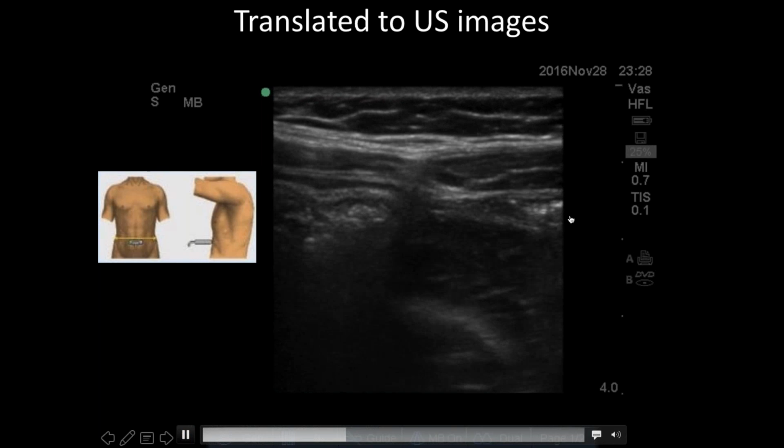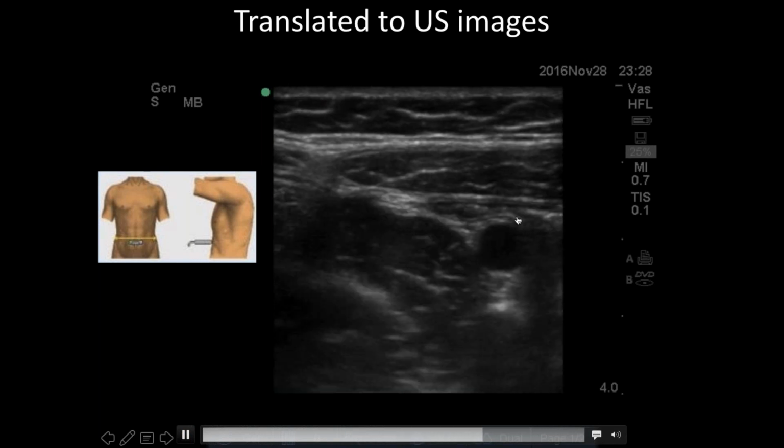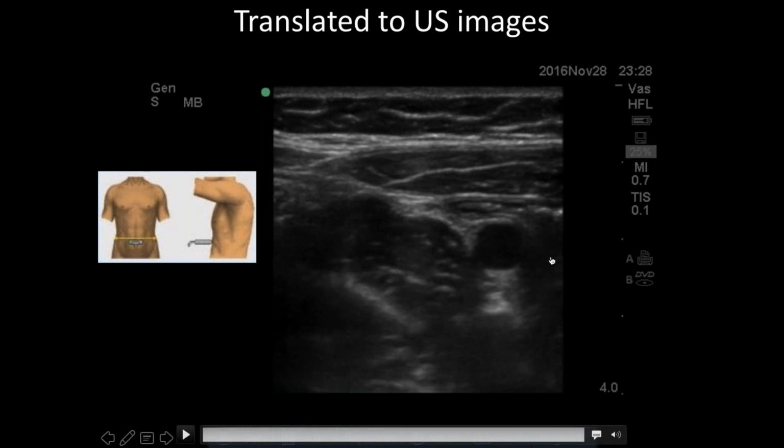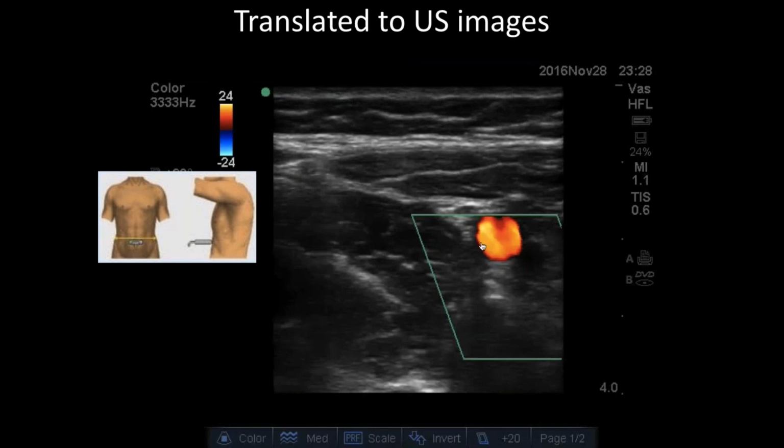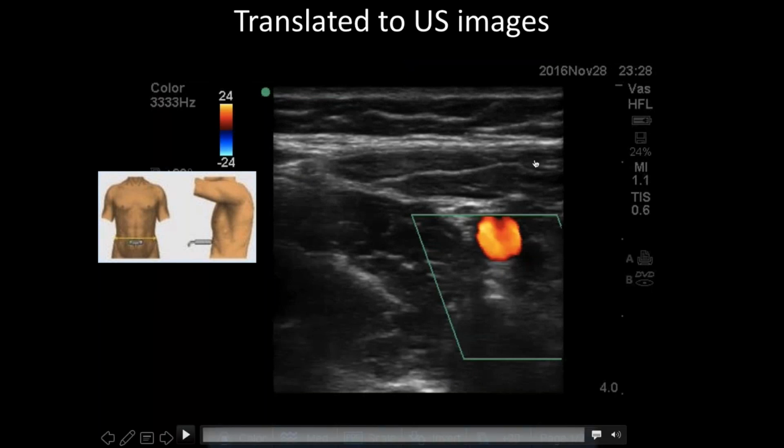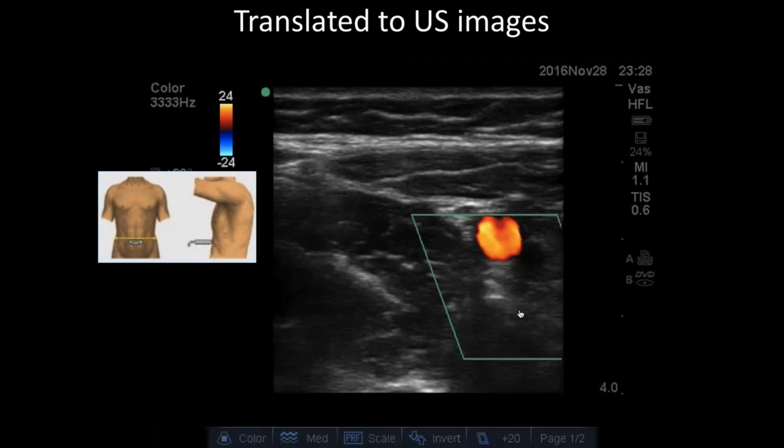Large bowel, psoas. This area here is all small bowel, and then as compression goes on, boom, it brings in that small bowel, and it's kind of over that iliac vessel. We're going to have to prove that this is iliac vessel, so I usually put some color Doppler on to make sure that I'm happy that this is iliac vessel. And then, like I was saying, rectus abdominis, it's right up there. See how close everything comes together when you're putting compression.